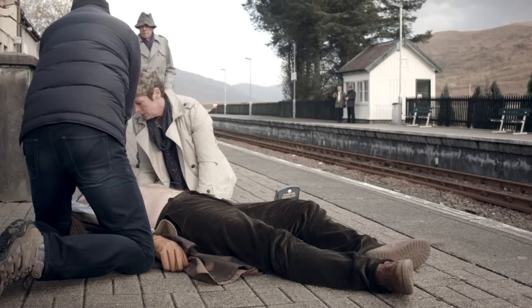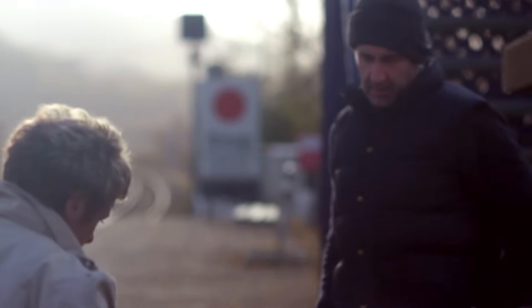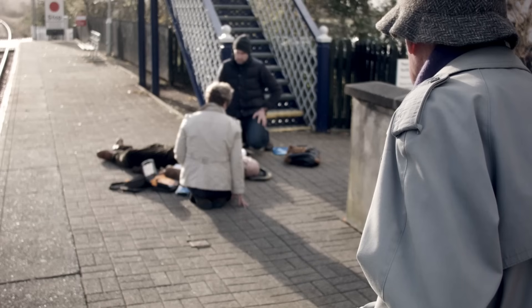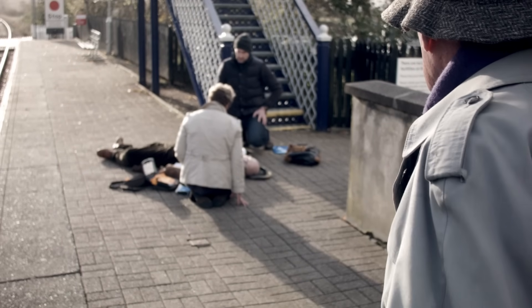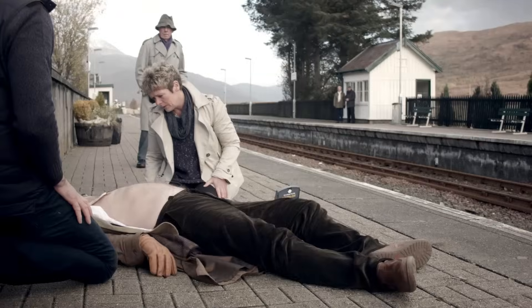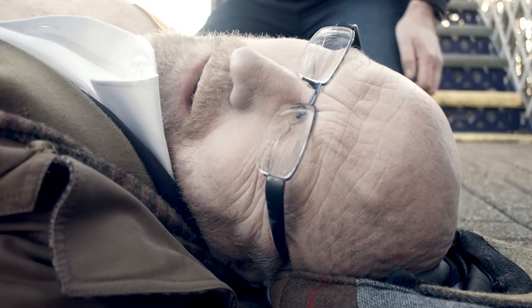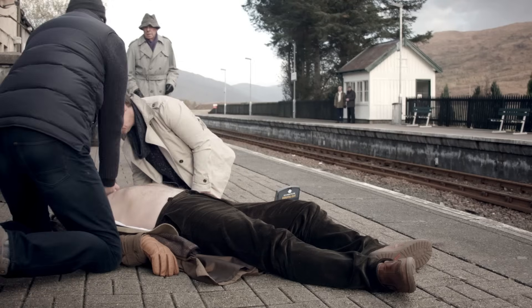Do not touch patient. Evaluating heart rhythm. Stand by. Preparing to shock. Everyone clear. Do not touch patient. Delivering shock. Shock delivered. Provide chest compressions and rescue breath.